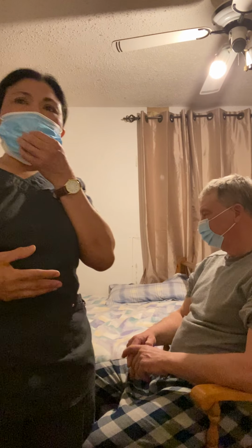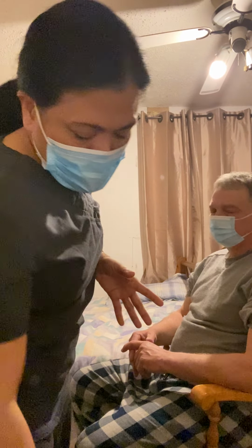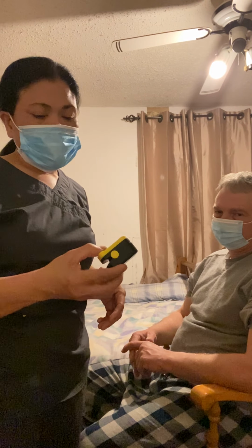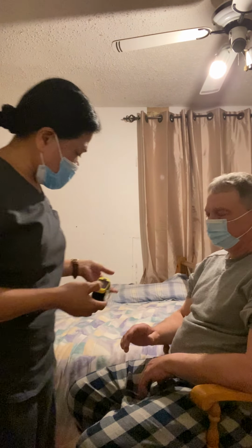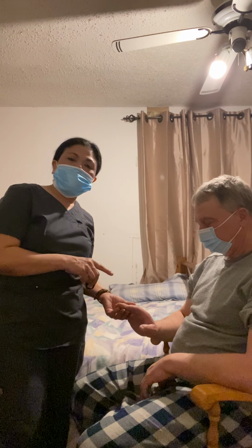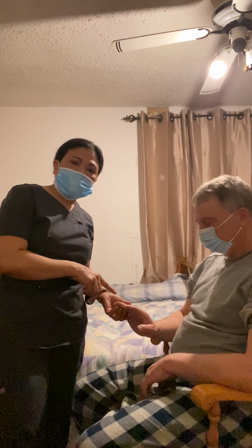So the next thing we're going to do is find the patient's oxygen saturation. To do that, we're going to use this portable pulse oximeter, or we can also use the one that is connected to the bedside monitor. We find the nail bed of the patient and put the device there, because that's where we get the reading.